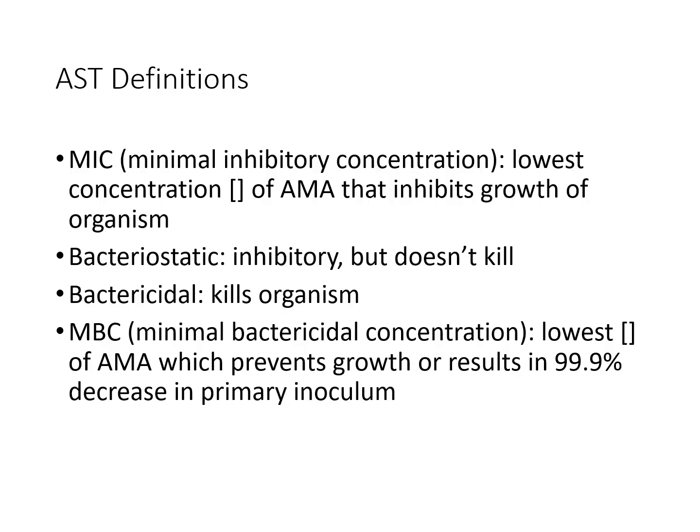Then you have the MBC, or the minimal bactericidal concentration. This is the lowest concentration of an antimicrobial agent that prevents growth or kills 99.9% of the original bacterial inoculum. This helps differentiate between bacteriostatic and bactericidal activity.